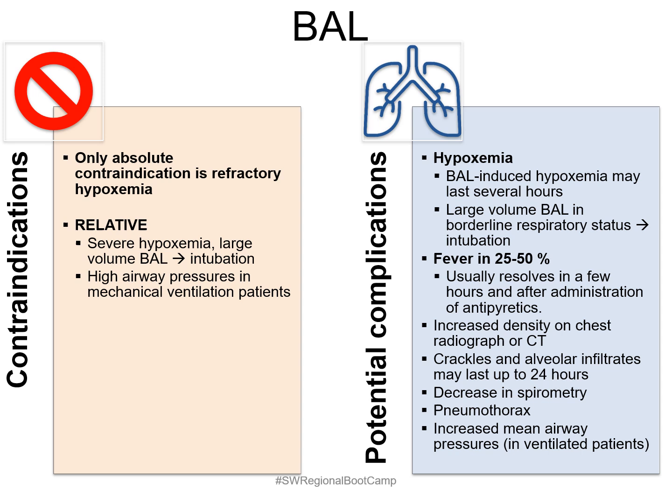So what about the potential complications? Hypoxemia is one of the major complications or consequences of BAL, and it may last for several hours after the procedure. As a result, you should consider intubation for large volume BAL in tenuous patients with borderline respiratory status.